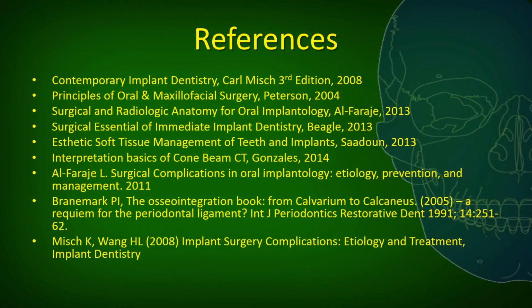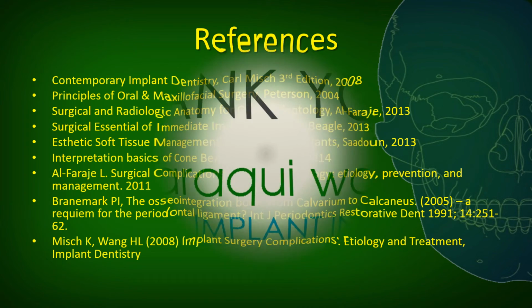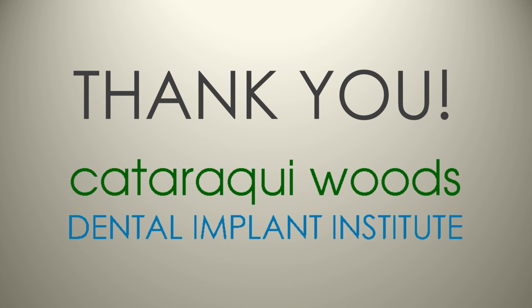And we're finally going to throw up just some final pictures of this case completed, of the actual crown inserted and with the final restorations, with Teflon plug and composite resin plug on the orifice of the UCLA abutment in place.